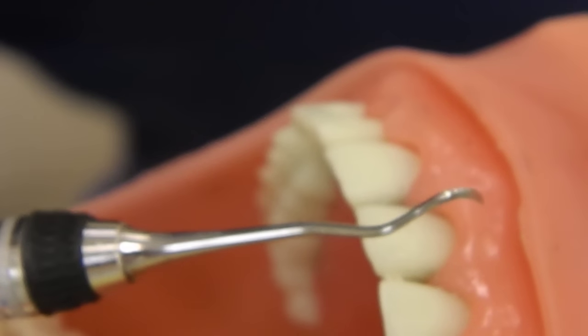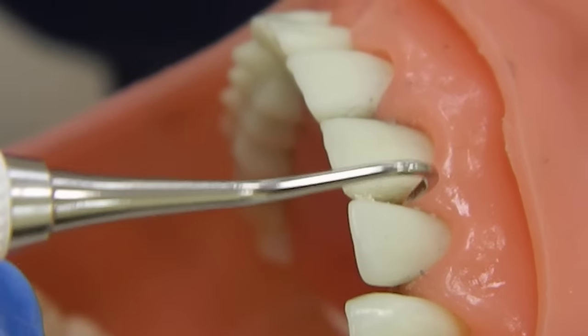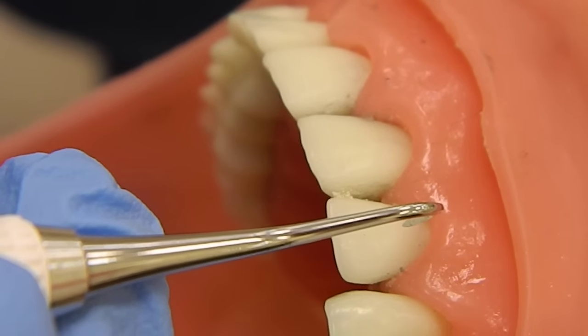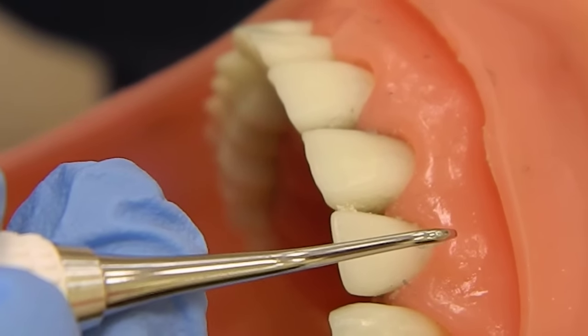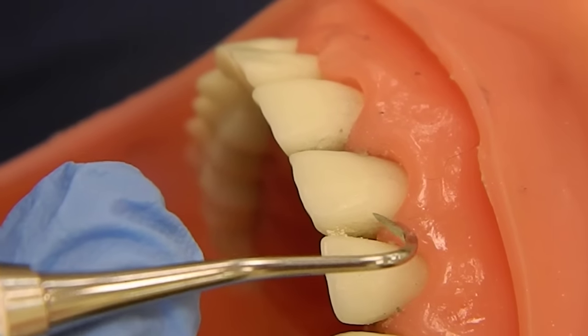We're going to start with anterior first, beginning at tooth number 10. You don't have to put the tip of the instrument on the tooth to determine the correct working end because there's only one end. We're going to start on the side of the tip, doing the towards surfaces at 8 o'clock.